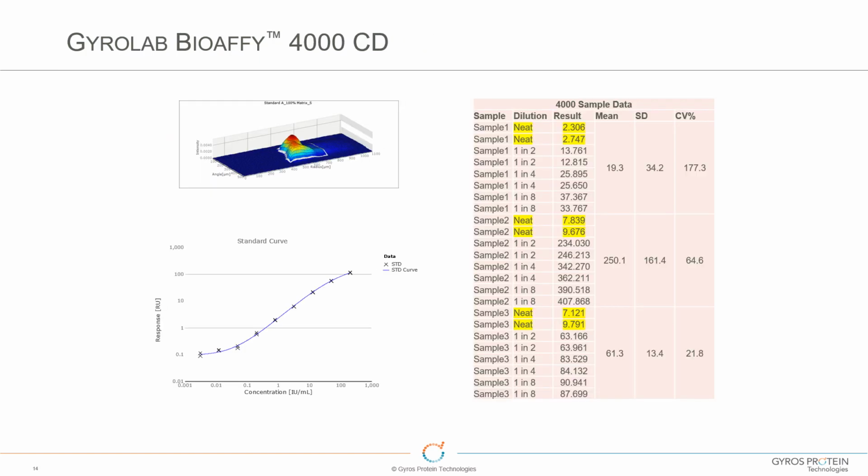All right, John, so why don't you walk us through this first parallelism experiment, and you're using the 4,000 nanoliter CD, so maybe talk a little bit about why you picked the 4,000 nanoliter CD to start. So the main reasoning for picking the 4,000 CD for initial work is that during the pharmacokinetic profile, when the drug concentrations are really high, the levels of free IgE are extremely low, so we want really maximum sensitivity. So the 4,000 CD will introduce the most sample volume, so increasing the chances of measuring very low concentrations of IgE.